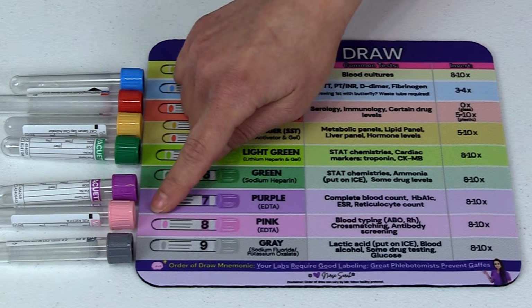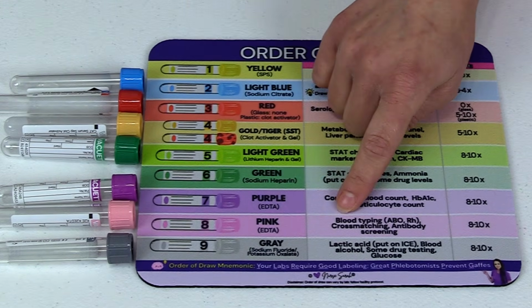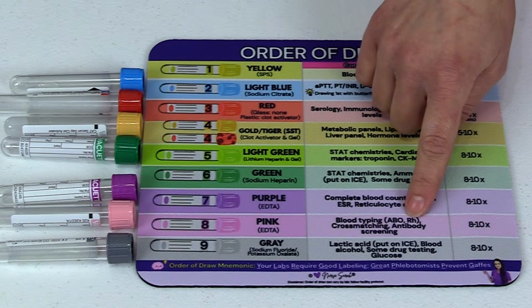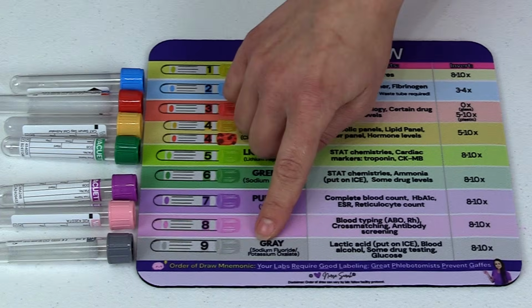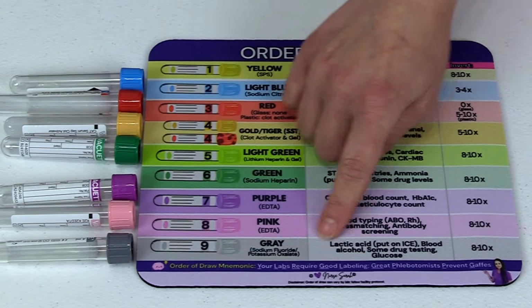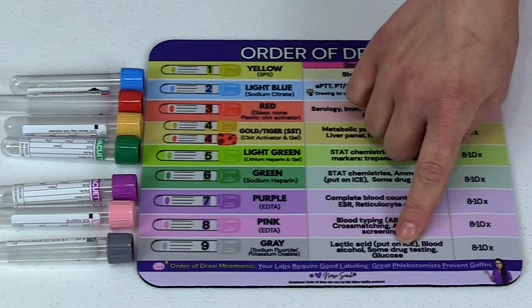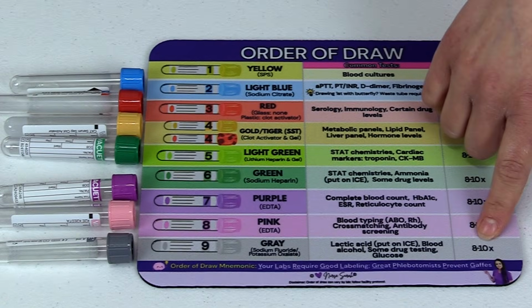Followed by the pink, which has the same additive as the lavender, the EDTA. This is your blood typing, like your cross-matching, type and screening. Inversion time 8 to 10. And then gray, this has sodium fluoride and/or potassium oxalate in it. This is going to be like your lactic acid, again put that on ice, and blood alcohol levels, glucose, and its inversion time is about 8 to 10.